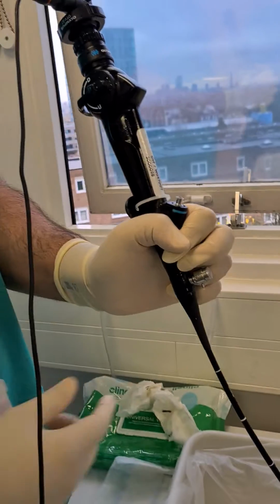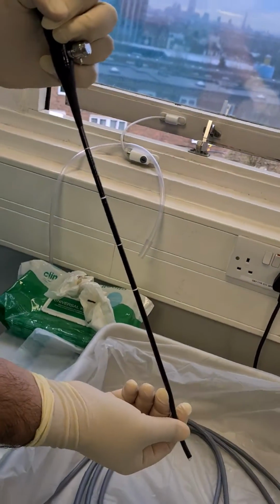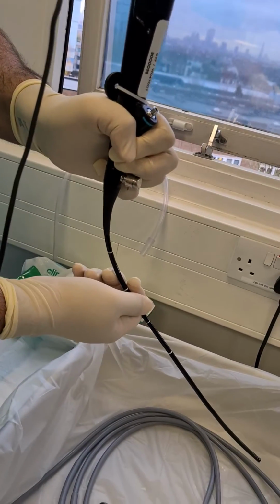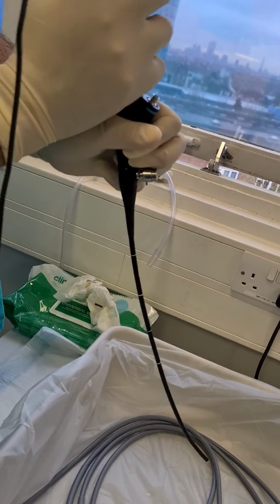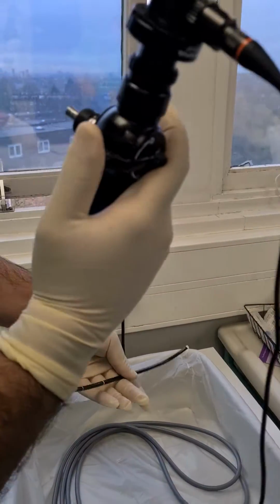Alright? And this is the shaft of the scope. It's like 35 to 40 centimeters long, and it helps us to go inside the bladder and look a little easier without causing trauma. And by manipulating this like this, you can rotate and go inside and have a look.